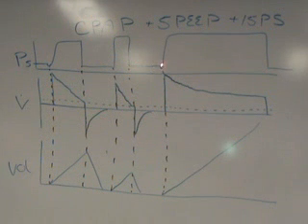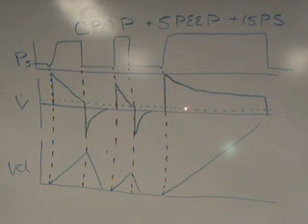The third breath, something interesting happens. The patient triggers the breath. The pressure goes to the pressure support level, but if you notice, the flow rate doesn't decelerate all the way down to my terminal sensitivity point, or my terminal flow rate point, or the point that the ventilator cycles the pressure support off. This would be the case with a leak in the system, or possibly a leak around the tube.